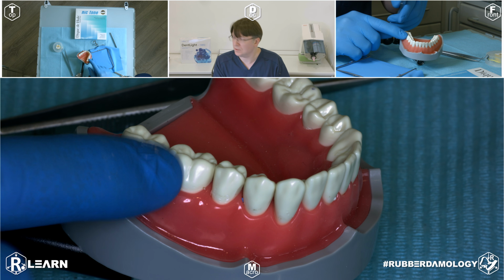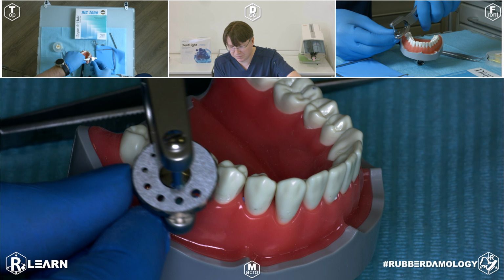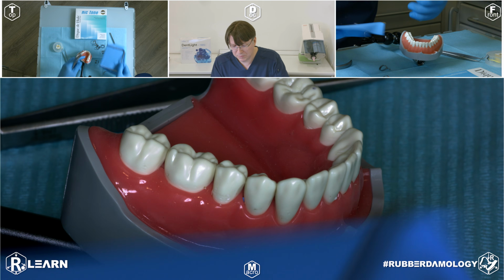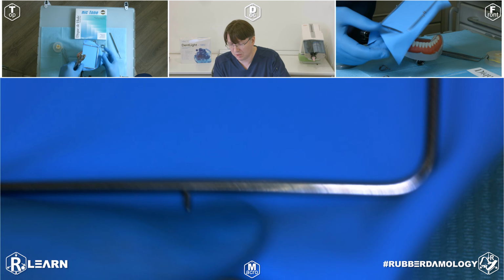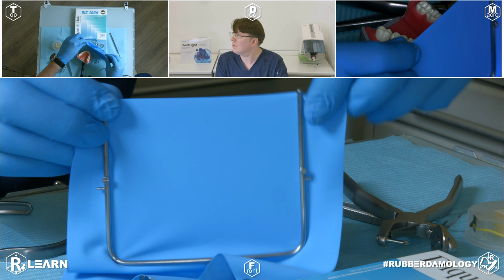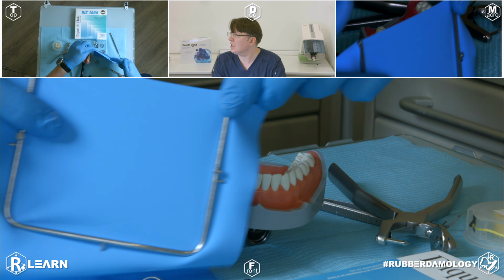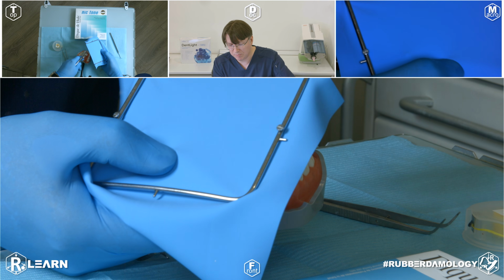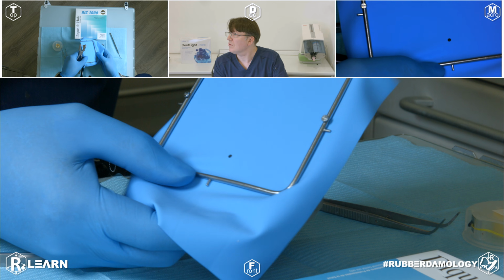Let's start from molars. I decided to make perforation number 2. If you treat only one tooth, make one perforation in the middle of your rubber dam plate. This is the surface of the full rubber dam plate. This is only the surface inside your metal frame, but we need the full surface and the perforation made in this area, such way. Very good.